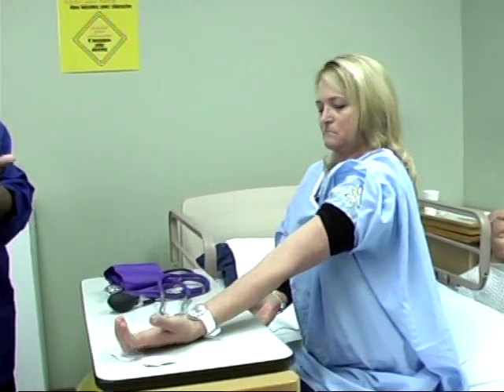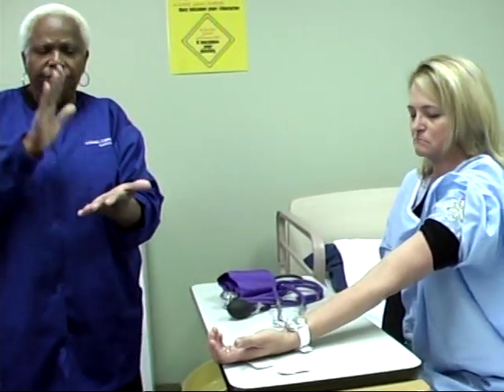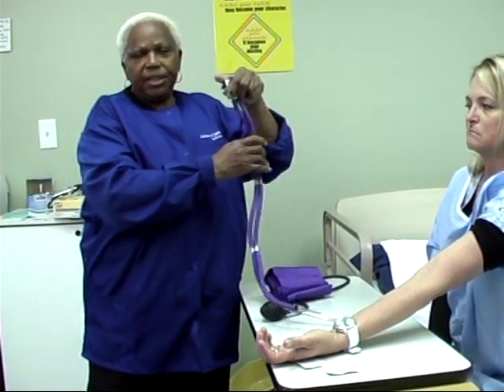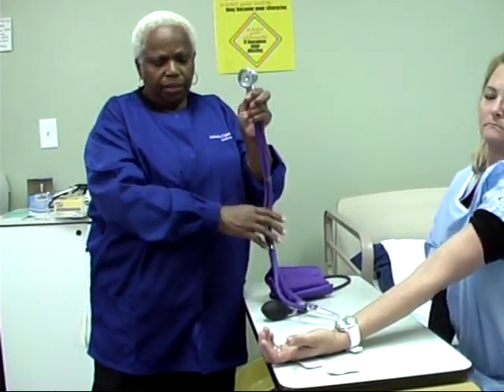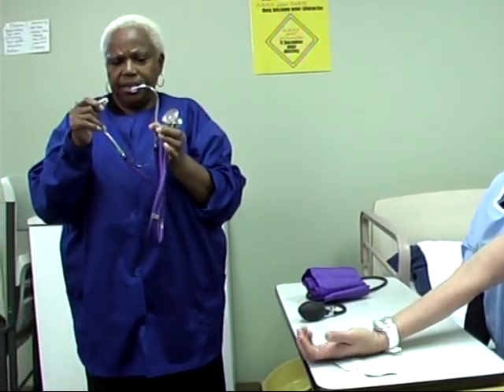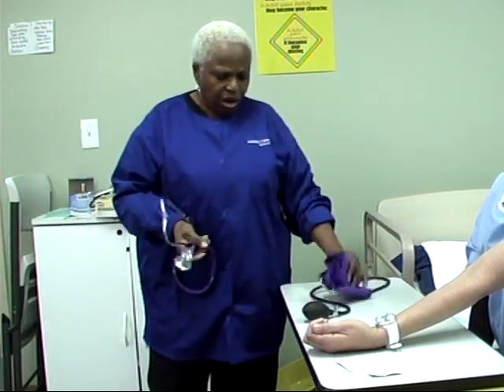So it will feel just like the pulse — you will feel it beating. And that is where you will place the bell. This is the earpiece and the diaphragm. You have to clean the earpiece and the diaphragm before you start.